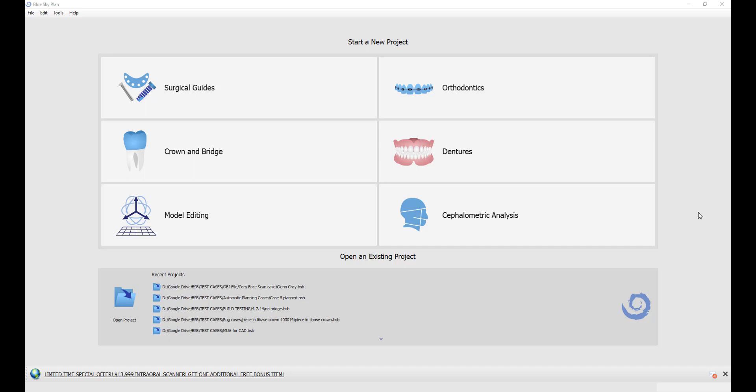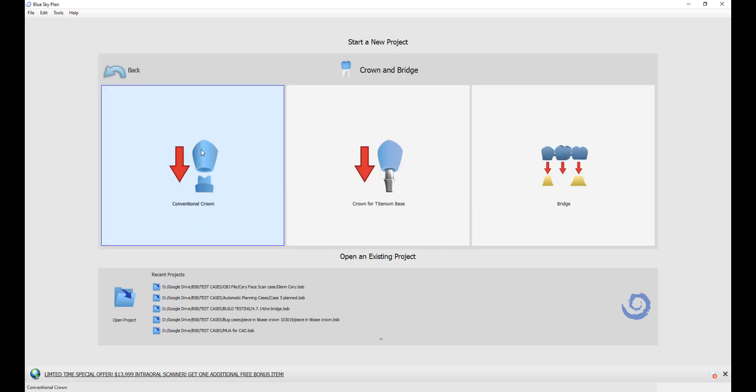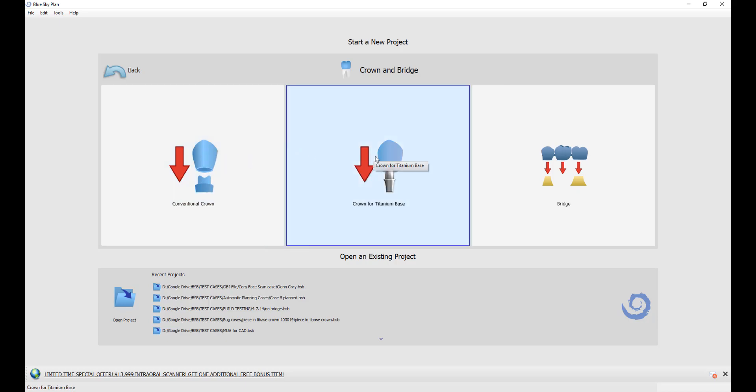I'm using version 4.7 of the Blue Sky Plan software, the latest version. We're looking at the initial interface that comes up as soon as the software loads. We're going to start the process by clicking on the crown and bridge button, and then choosing the option for crown for titanium base.